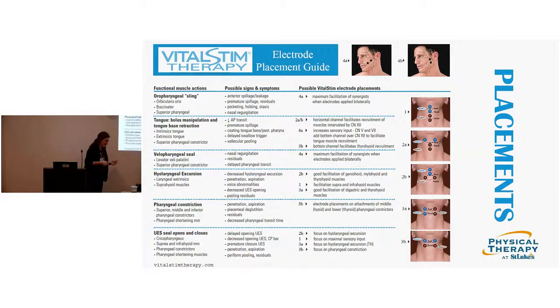Now, unfortunately, in outpatient therapy, two times a week is pretty standard, with our availability and the patient's availability to get to us. VitalStim is meant to be done 5 days a week, and that's just not plausible for outpatient. In inpatient, that'd be fantastic. If I can convince them to come three times a week and I have an opening, I will, but three times a week is the most you'd ever see me see a patient for VitalStim. So with that being said, we might not see those results in those 6 weeks. We're going to have to wait a little longer and really delve into it. There are a lot of things to take into account, like insurance and availability and all that messy stuff we deal with in outpatient.